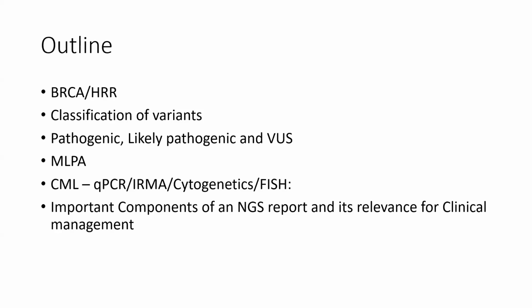And then moving on to CML, I will be walking through a qPCR dummy report as well as an IRMA dummy report, explaining how we interpret the results for BCR-ABL measurement, and then background on cytogenetics and FISH, and then a brief overview of important components of an NGS report and its relevance in routine clinical practice.